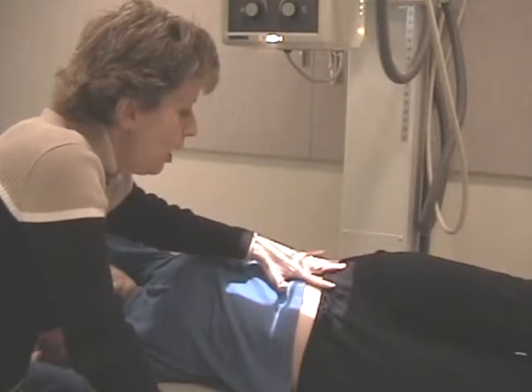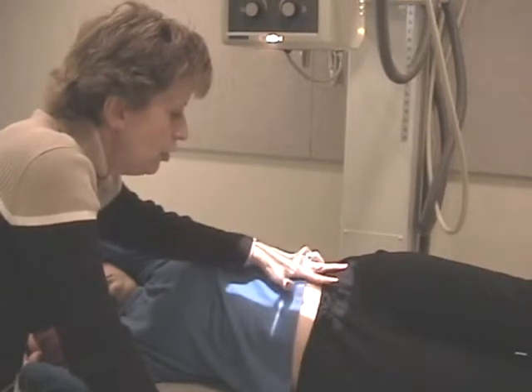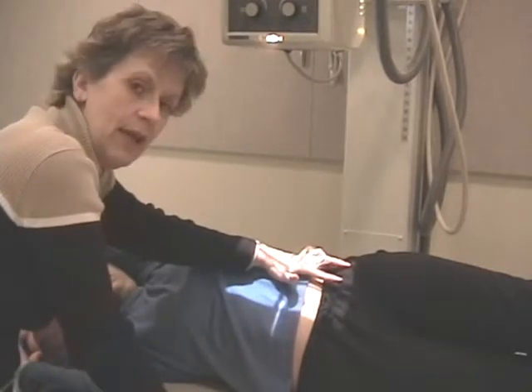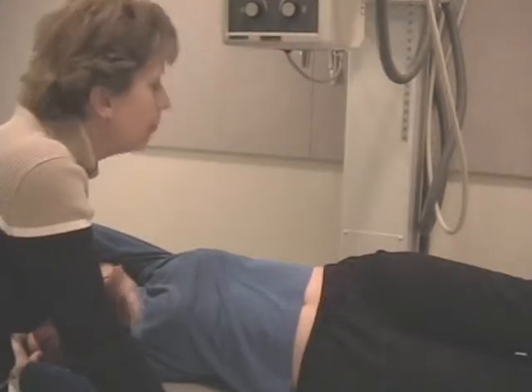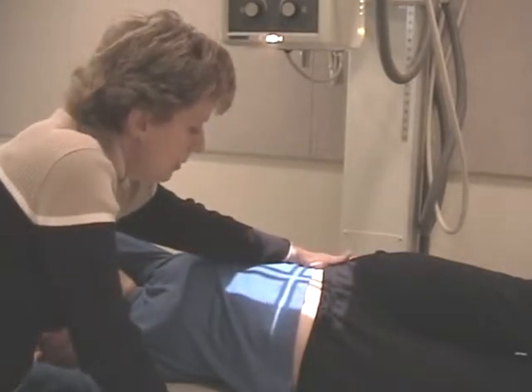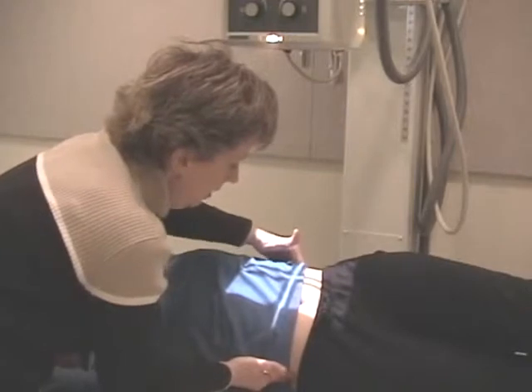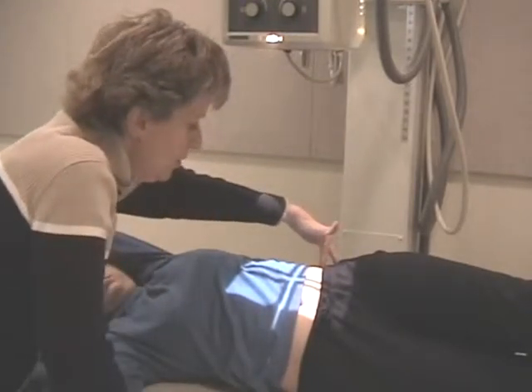And I want this crosshair, the one that goes head to foot, approximately 2 inches from that. It's the plane that's approximately 2 inches from that ASIS. I'm trying to put the patient's spine to the center of the film. I'm going to find the iliac crest. Again, I'm using my flat hands. I can come from this relationship on both sides, find the iliac crest, and then the crosshair will be 2 inches above that.